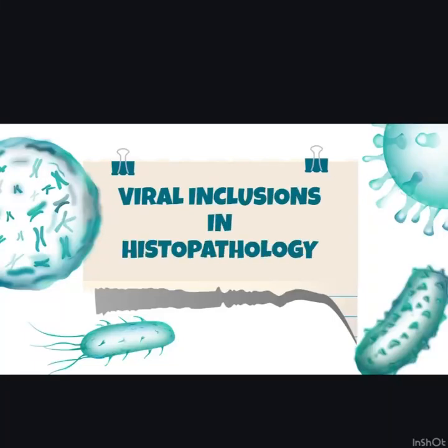In today's video, we will discuss an important histopathology topic that every pathologist should be familiar with in daily practice. Since these findings are relatively common and can sometimes be mistaken for atypical or even malignant changes, understanding them is very essential to avoid misdiagnosis. So now we will study viral inclusions in histopathology.